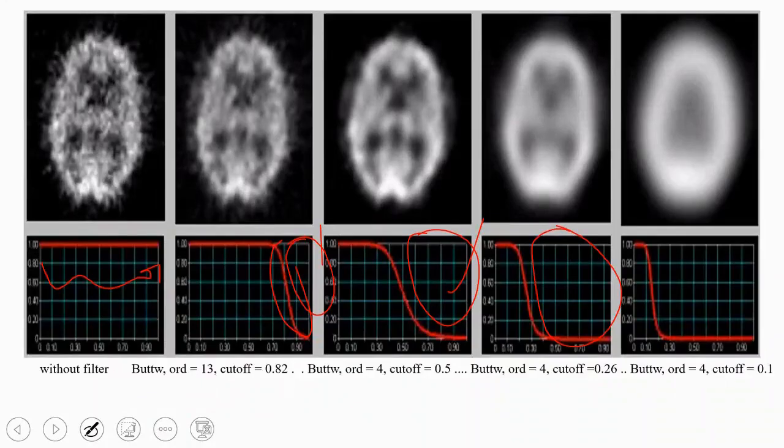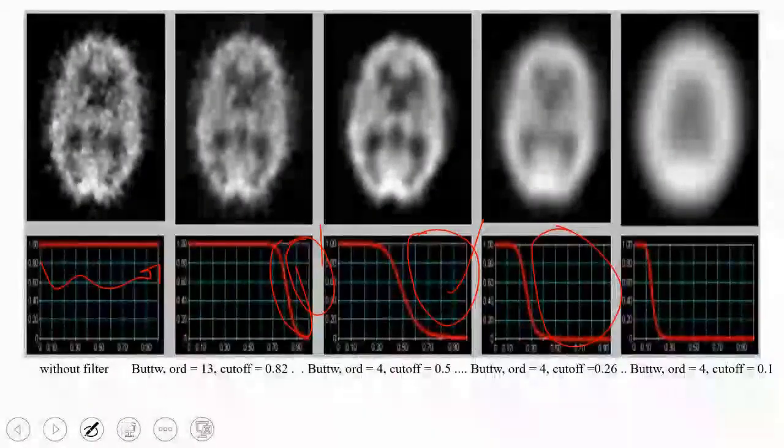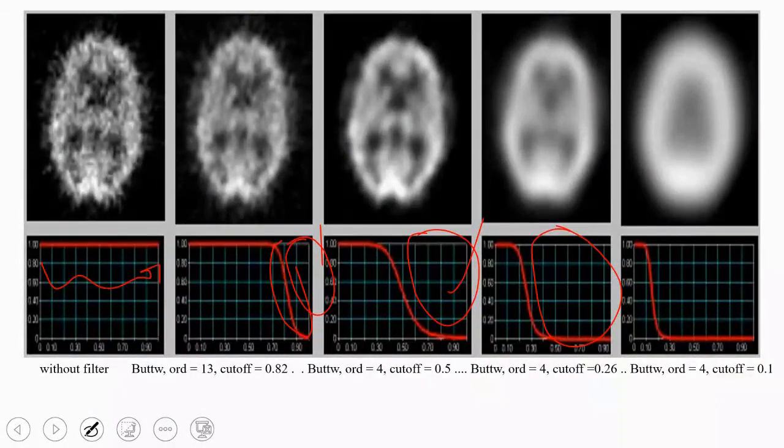What's up, doctor? Is it at the expense of resolution? Of course, it's at the expense of resolution. Every time I look, doctor, a little bit of resolution doesn't hurt. I mean, if you have a little bit of noise, it doesn't hurt. You need the resolution. You should do optimization. For example, when you move to CT, you see the child's image is very smooth. This happens sometimes when a small child comes in for a CT abdomen. You find the liver is very smooth, the image is very smooth as it should be.